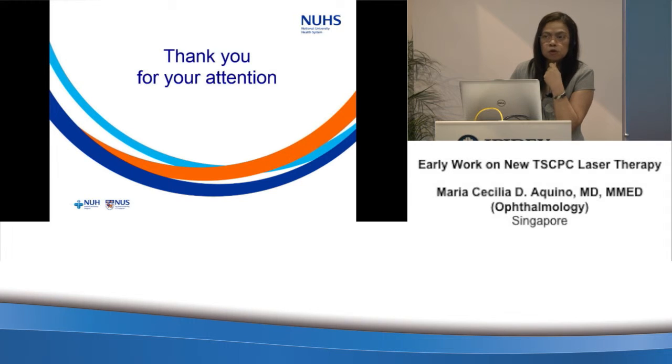In the majority of the cases, those that had very high pressures, 40 and above, they are on maximum meds already, multiple maximum meds. And immediately after, in most of them, the following day, you can already elicit a change. So you expect in the majority of patients, regardless of their pressure, the very next day, to see a substantial lowering of the intraocular pressure? That was the experience that we had from treating those patients with 40 millimeters of mercury and higher. Although, of course, you won't reach a target of 21 immediately, some of them had a response immediately, day one of the post-op follow-up. It registered already a response from the laser.